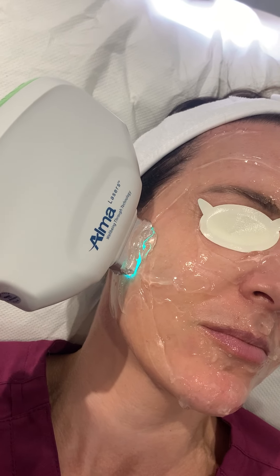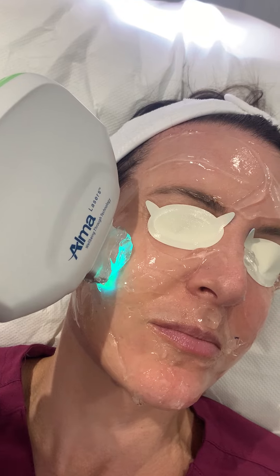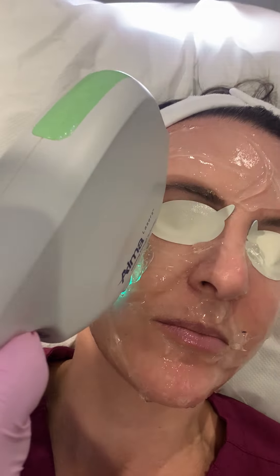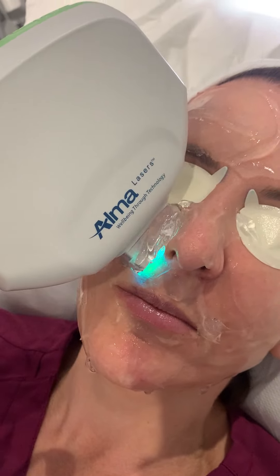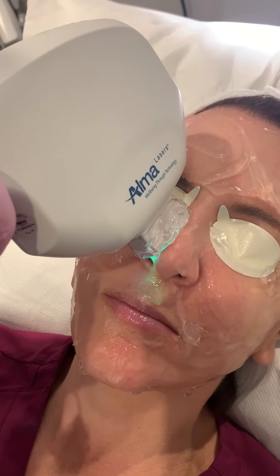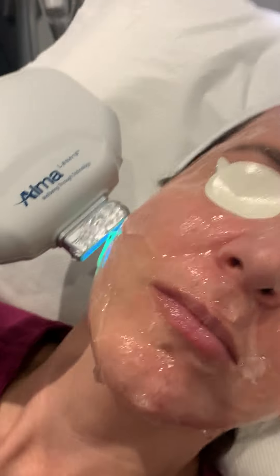With gentlemen, when we do this, we have to warn them that it can affect the growth of their beards — because this is the old-fashioned way to do laser hair removal. Although this is not a laser; it is intense pulsed light, which is slightly different. This is a broad spectrum of light rather than a very focused, narrow band.